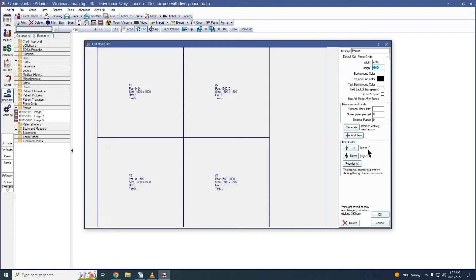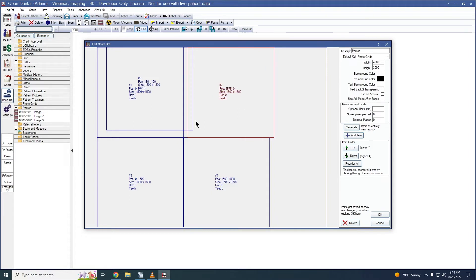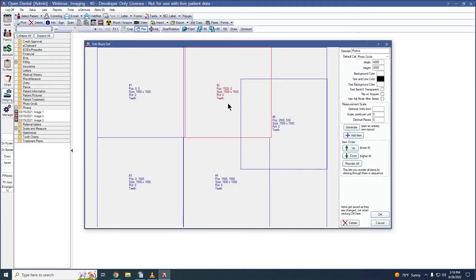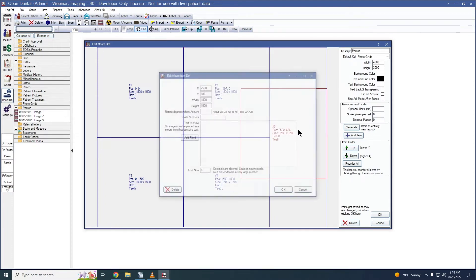I can use the item order to reorder the items on my mount. I can select an item and use the up and down arrows to change its position, or I can click Reorder All, which sets the item order to zero for all items. Then I can click through my items in sequence to number them. We can also click Add Item to create a new image item on our mount, which I can then click and drag to the desired position.